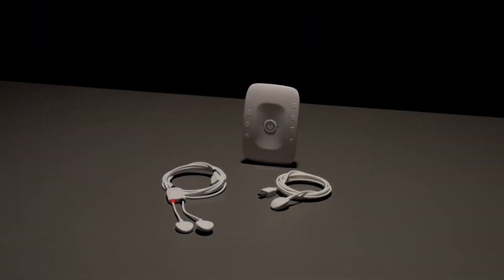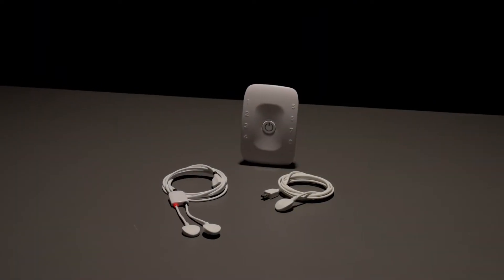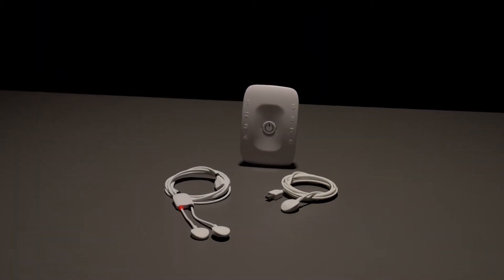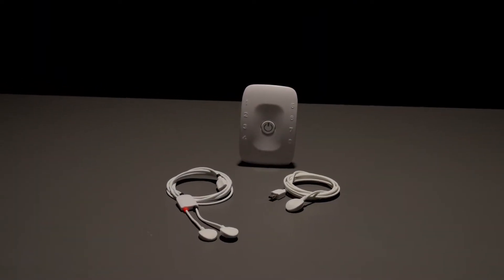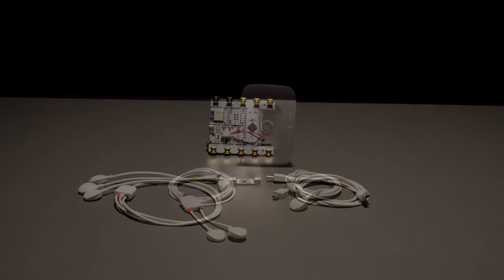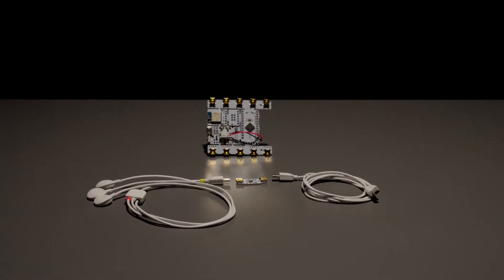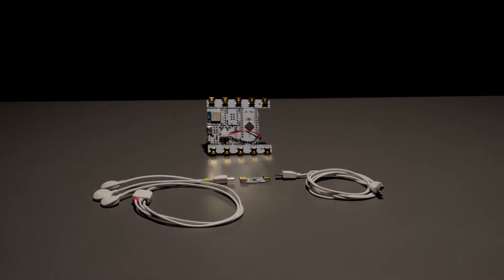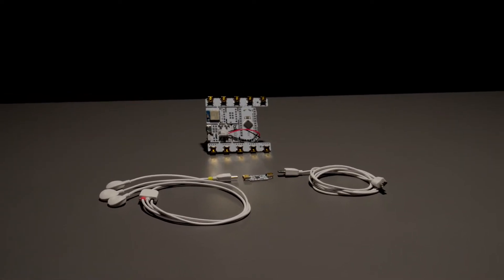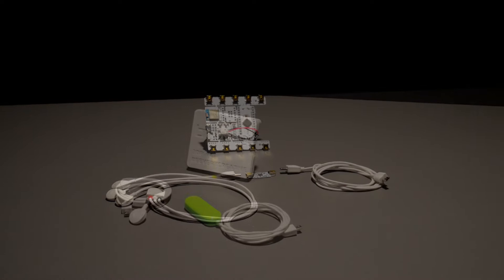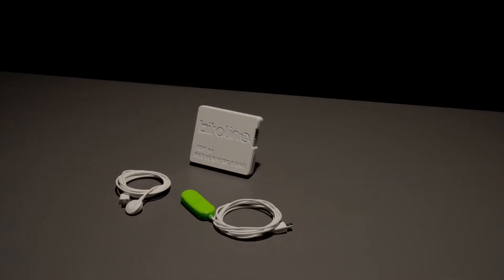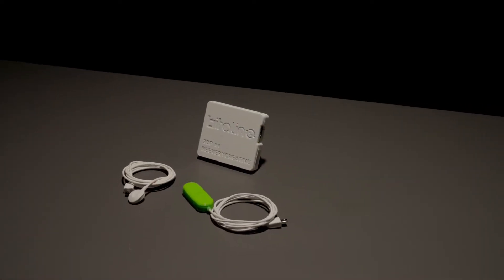Hello! Here at PLUX, we are always available to help every biosignal enthusiast. For those who are looking how to place EMG electrodes the right way, stick around, because this tutorial is for you!